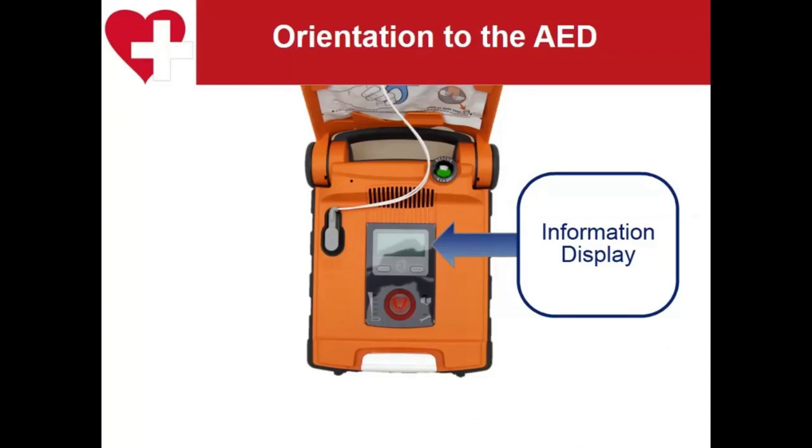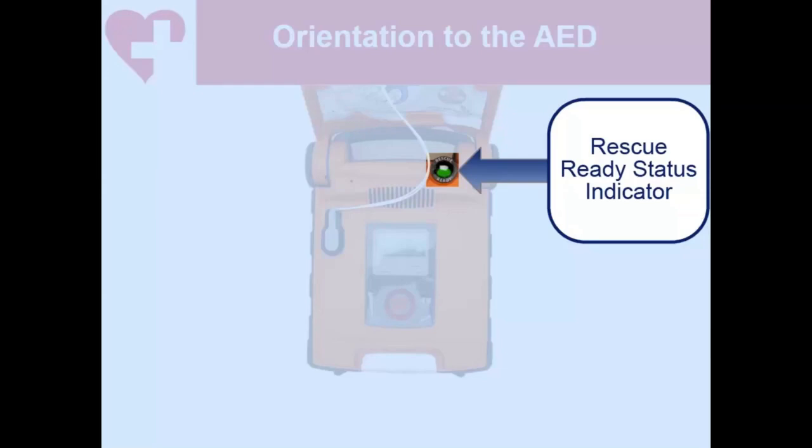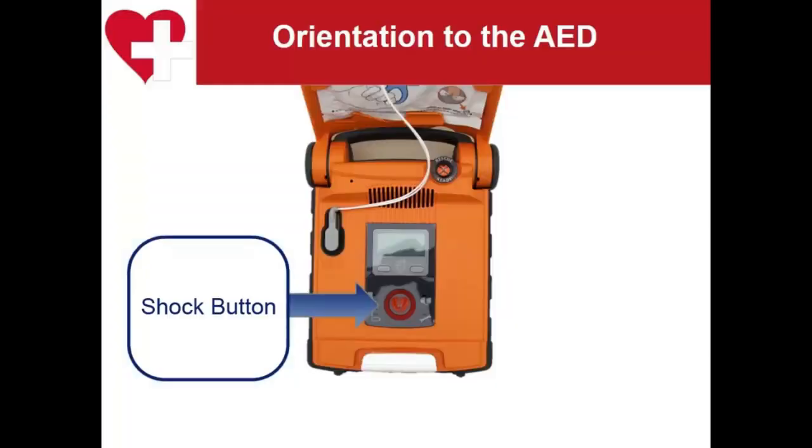Number of shocks delivered and rescue time is also displayed. Rescue Ready Status Indicator. When the status indicator is solid green, the AED is rescue ready. Rescue Ready technology assesses the AED, battery, and pads to ensure they are ready to perform a rescue. If the status indicator displays a red X, the AED is not rescue ready and it has failed its latest self-test. Shock button. This will light red when the AED is ready to deliver a defibrillation shock.